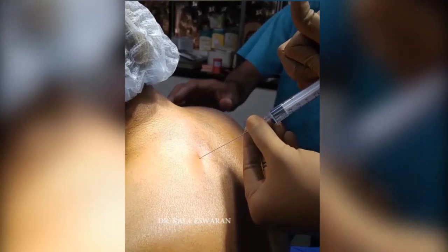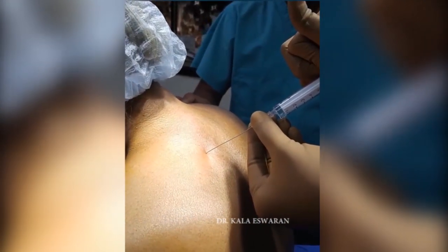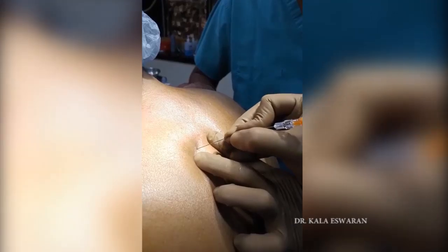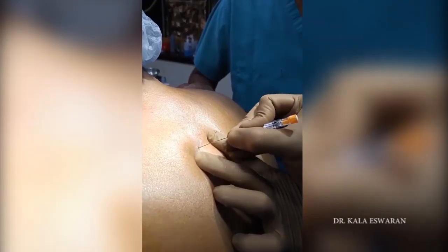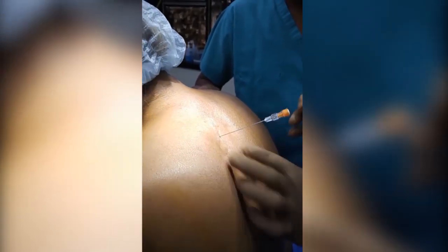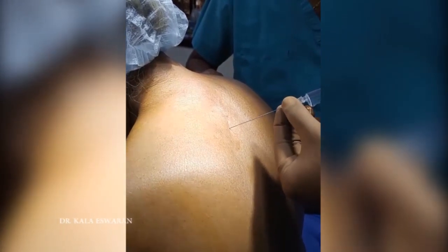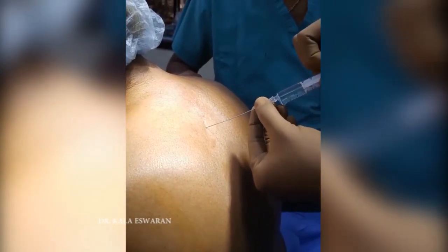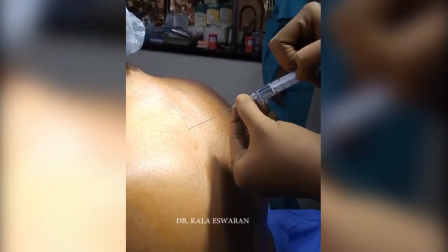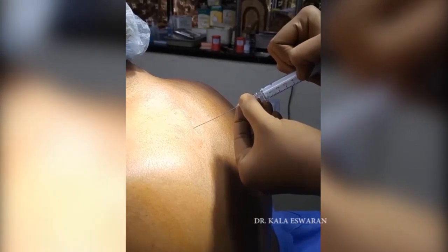It is a potential space — it is not a space like an epidural or a spinal — therefore you may find some amount of resistance here. Every time I keep the finger on the superior aspect of the spinous process, and every time I am aspirating for blood; I inject only after negative aspiration.